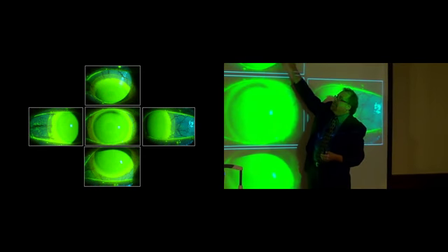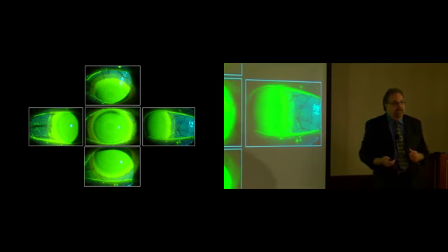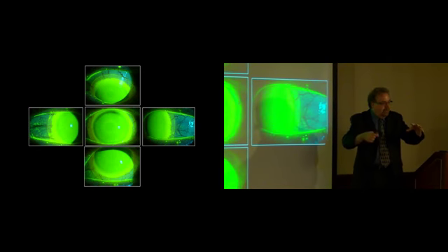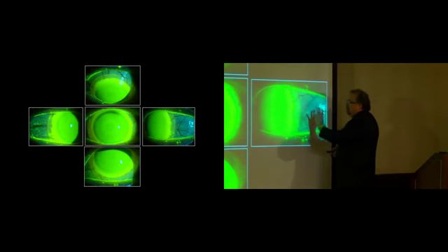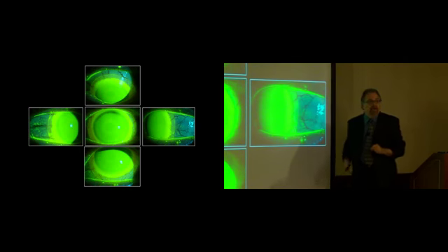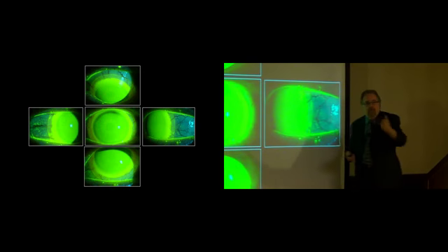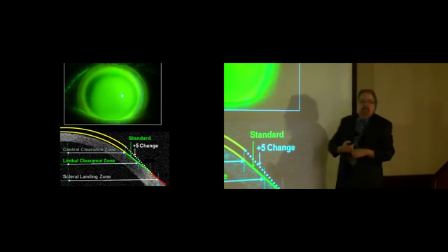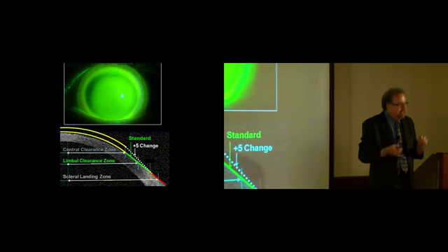When the patient gazes down, fluorescein does come across that area. So it really is just a slight anatomical difference in the peripheral cornea, or in the sclera. So have that patient make those excursions and make sure we're getting clearance of the contact lens in all 4 quadrants of gaze.